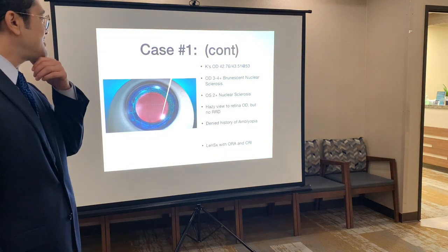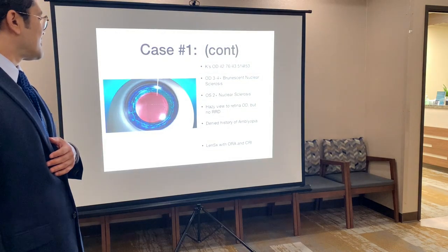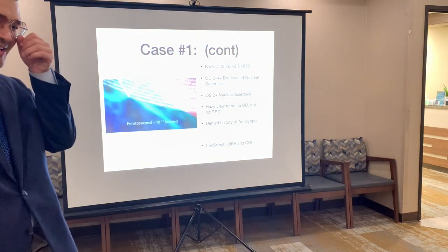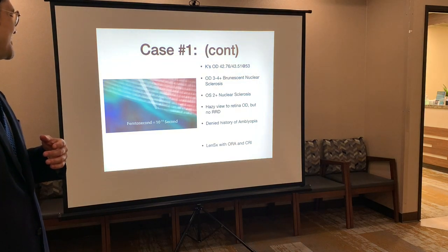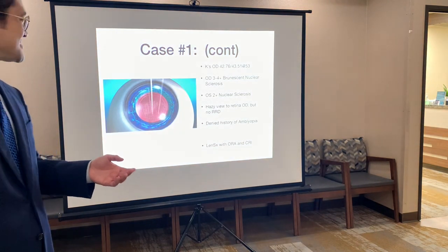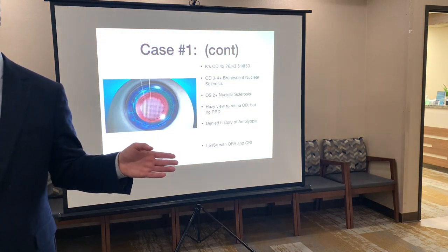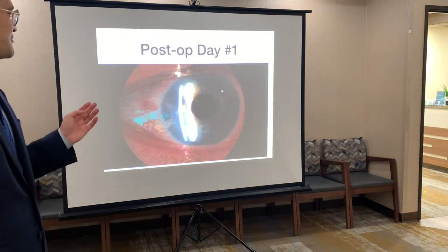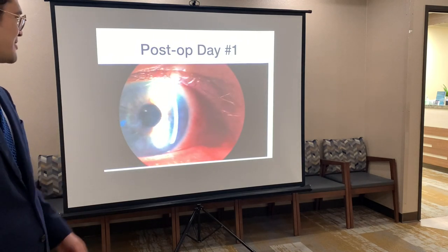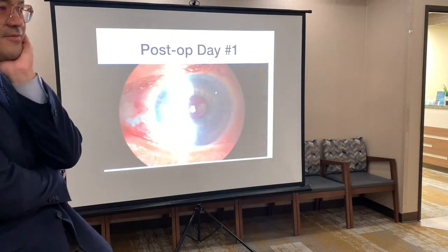And so we did cataract surgery, we did it with laser. There's the laser one more time in case you forget. The laser does all these cuts, it breaks up the cataract. Each little zap, and this happens so quickly, we're talking seconds. Faster than that video, that's how quick the laser is. This is what she looked like on the first day, really clean cornea, and she already was 20/20, I think, on that first day. So, beautiful day one. That's what we like.